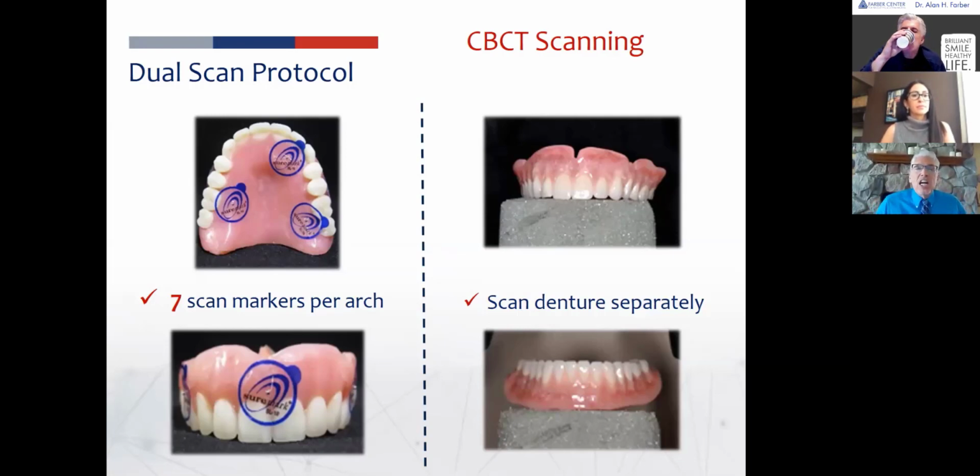If you're going to do a lot of these cases, Heraeus makes an impression material, and you can even check with your Patterson or whoever you're distributing with. There's actually radio opaque impression material that works. It still has all the accuracy, but it's radio opaque. That's very nice as well. Or you could do a reline on it. We do find that even a soft chairside reline with MucoSoft will come up somewhat radio opaque, so you can capture the actual anatomy without having to spend the money doing a reline on a denture. I hope that makes sense. What we're looking for when scanning this denture is another aspect of the anatomy. We are validating so many different points. We have 5 reference points of validation that are proprietary to us. That's what makes our system as successful as it is.